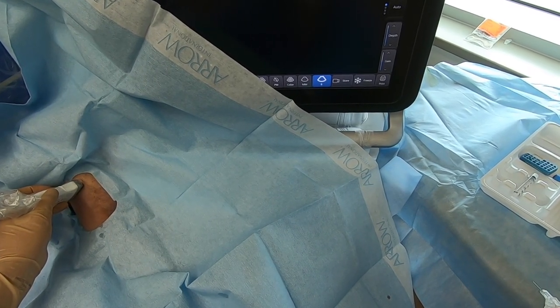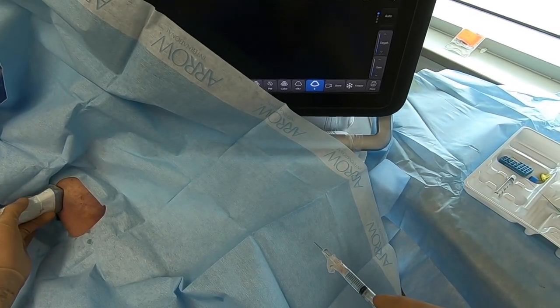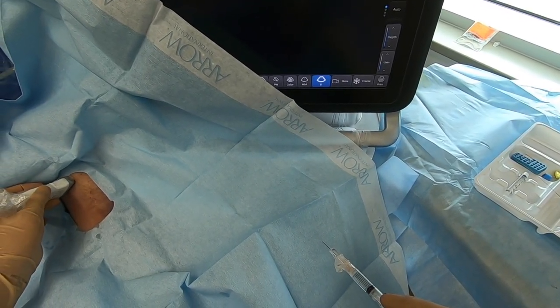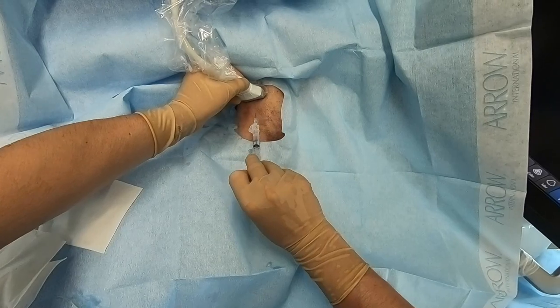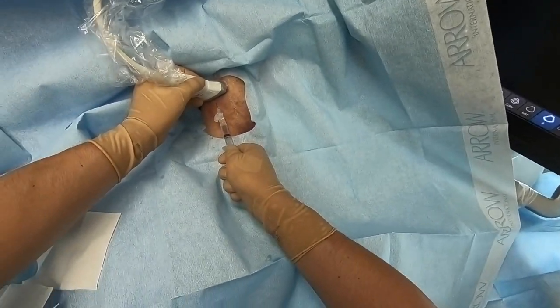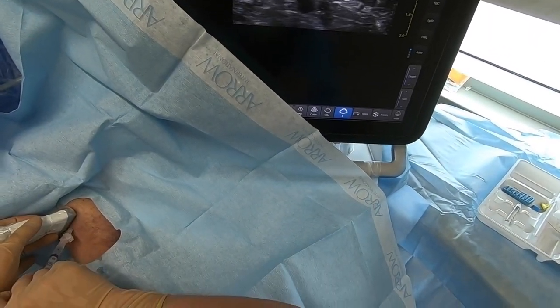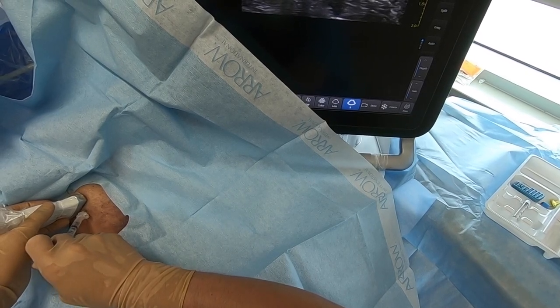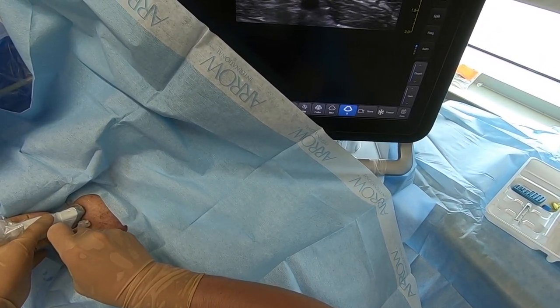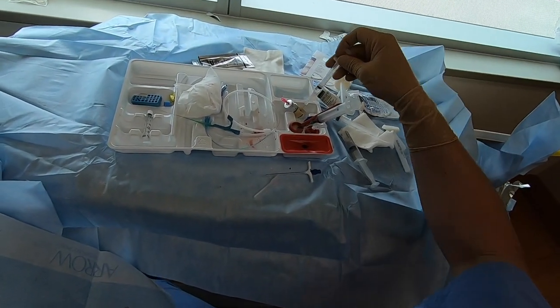We found a good vein here, so we're going to infiltrate lidocaine in the usual manner. We're using a small bore needle, lining up with the vessel and holding the syringe at a very flat angle just to raise a wheal at the skin. Then we're going to infiltrate in a deeper tract guided by the ultrasound. It's good to numb deeper as well — the dilator can be a little uncomfortable otherwise. We're going to try to numb right up to the level of the vessel.